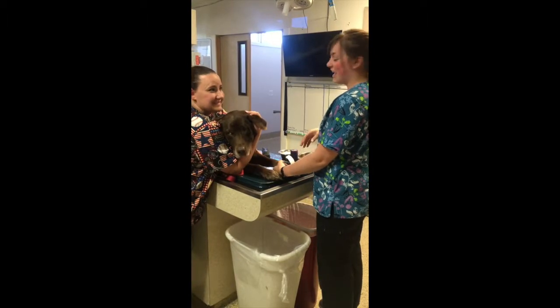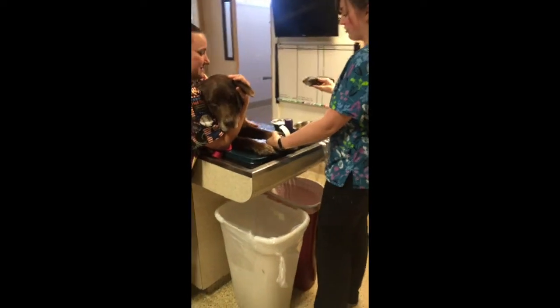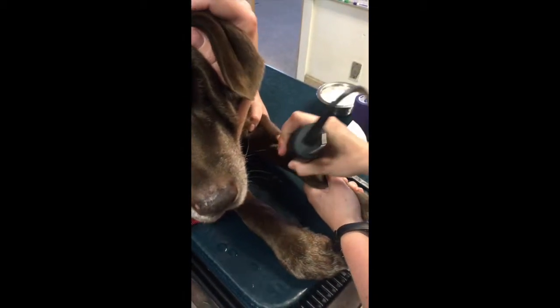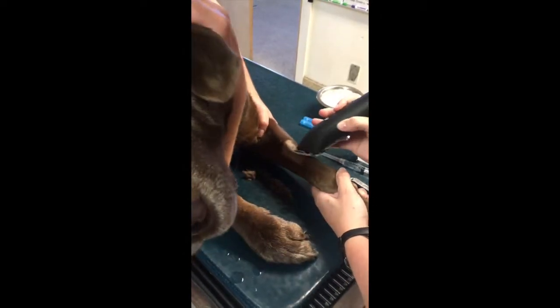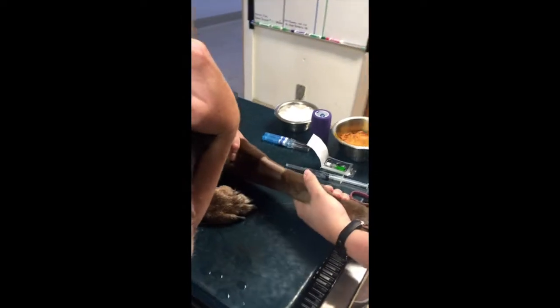Alright, I'm going to be setting a cephalic catheter on Ruger here. So the first thing I want to do is I want to go ahead and shave. I'm using a size 40 blade. I'm going to go ahead and shave a spot. Alright, once I have that shaved, I want to go ahead and scrub the area.